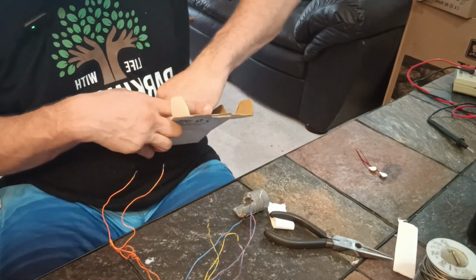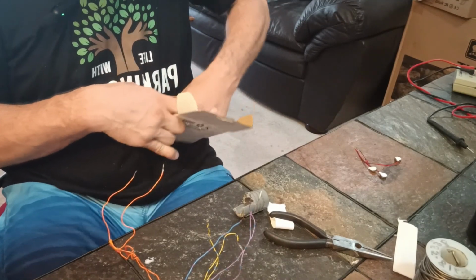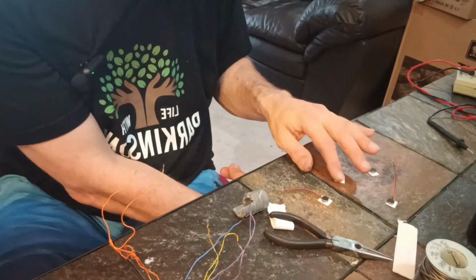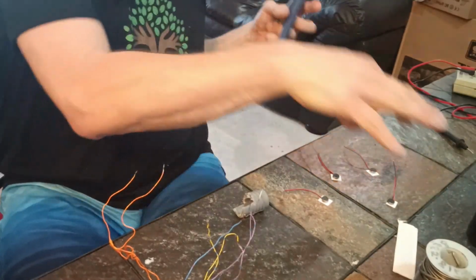Man, I've chewed up a lot of motors learning this system, so I hope this information is of value. 4, and we'll trim the wires. This could go pretty quick.